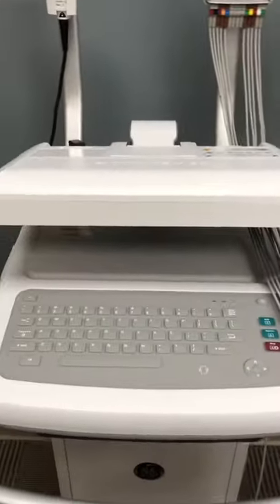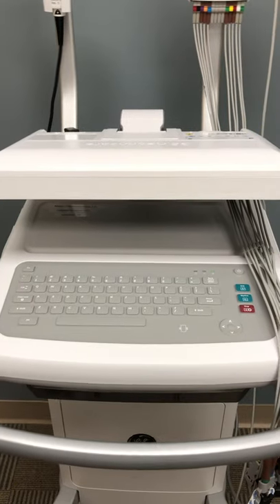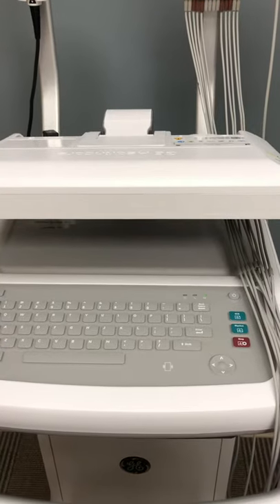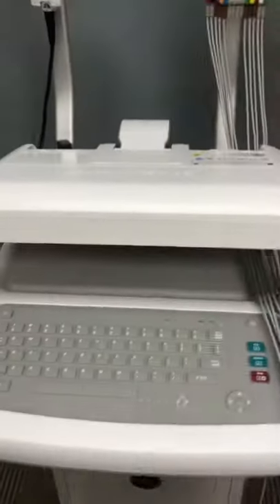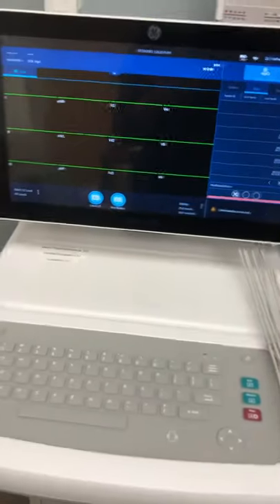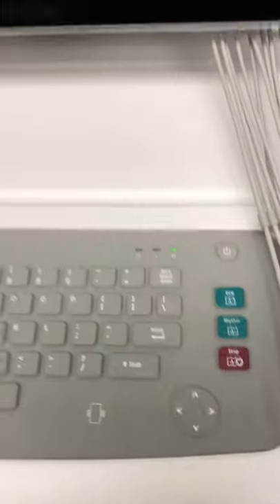I would recommend leaving your EKG machine in sleep mode. It takes about 2 minutes to completely power on, so if you're in the middle of an emergency, it's not conducive to wait 2 minutes to get your EKG. As long as it's in sleep mode, the power light will still be on. To wake it up, grab it by the middle and lift up the screen — it turns on automatically. If the machine were completely off, press and hold the power button for 2 seconds and it'll turn on.